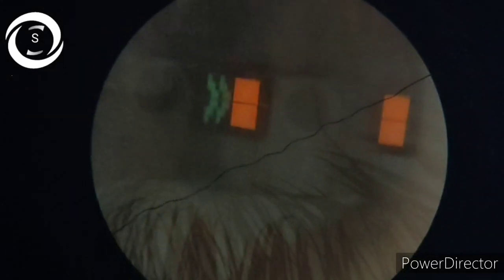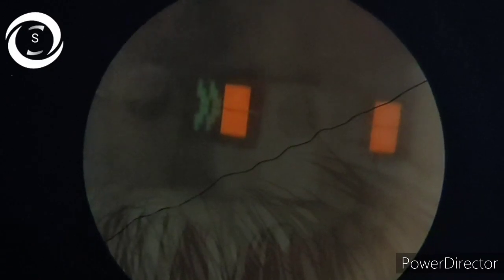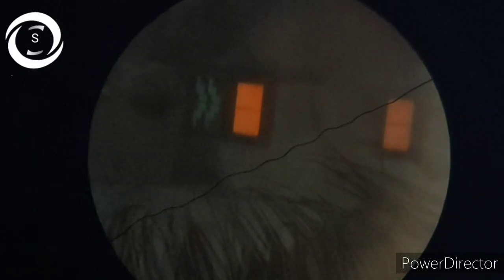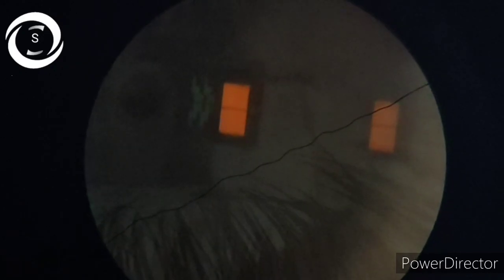And now we will focus it. I would like to show you through. Now that's how you see image through eyepiece, the red box and the green arrows. And as you can see these are well aligned with each other and there is no space. So that's the point where you take the reading of K1. And if there is a gap like here you can see there is a gap. Now there is no gap so that's the point where we take reading. Now again I have increased the gap and if there is this gap then the reading is incorrect. So you have to touch the green arrows with the red box, just touch not overlap it.